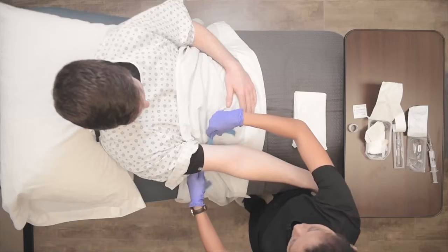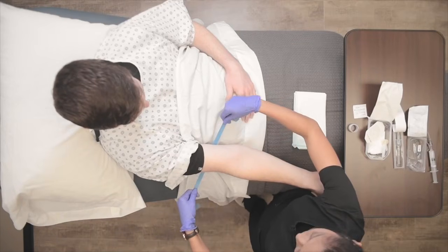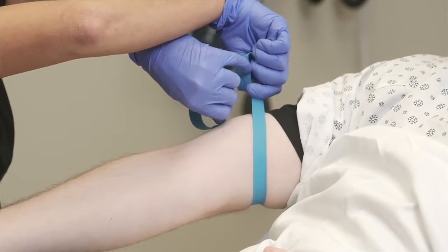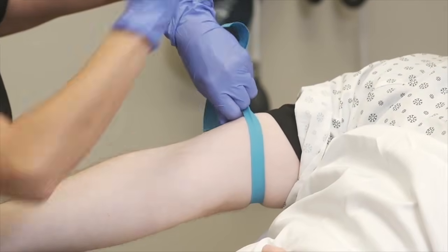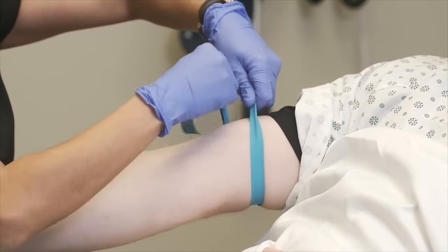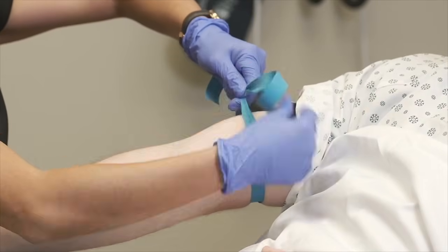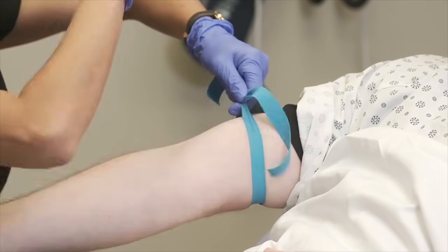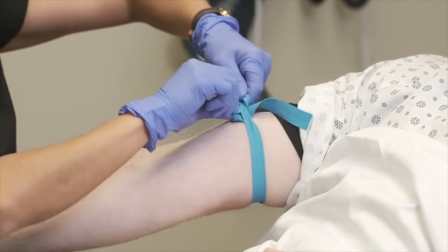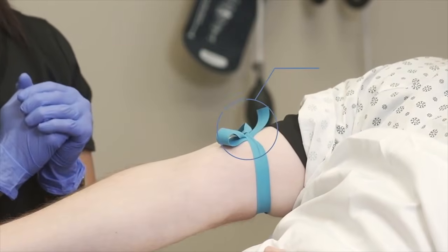Okay, so let's relook at this skill part. So when I'm putting on the tourniquet, if you will hold it nice and taut, close to the patient, cross over your hands. If you will hold on to it with the left hand, and we're trying to make an X. So once I've made that X, I can hold these together, and I'm going to loop this left side underneath, and do not pull it all the way through, and here we've applied our tourniquet.